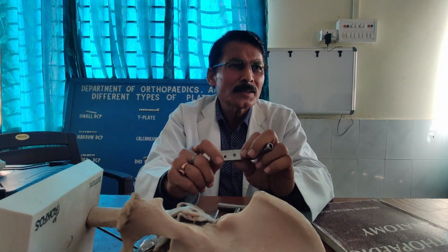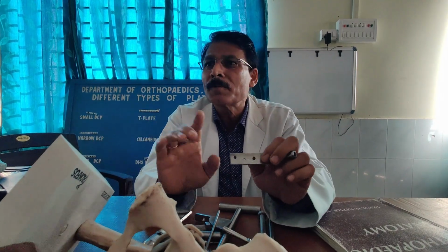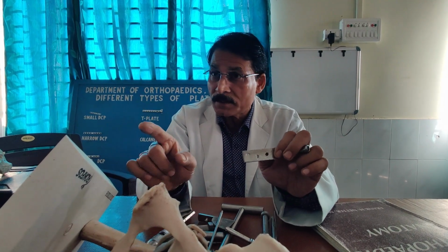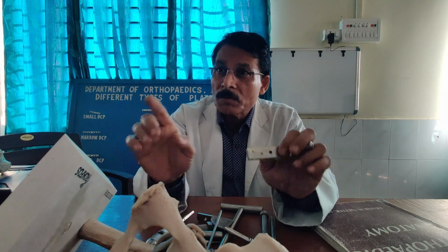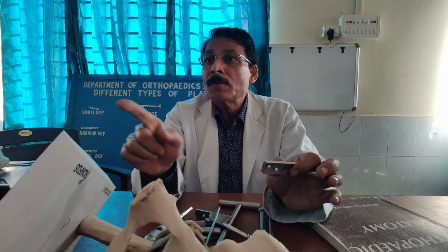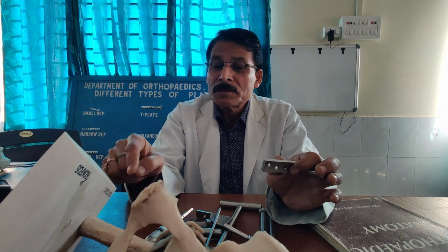So a longer plate is not needed, but in osteoporotic bone, if the extension is down below, probably that is where you are going to apply a longer one. One point. Length sometimes depends on the osteoporosis and also extensions in the selection of the plate.